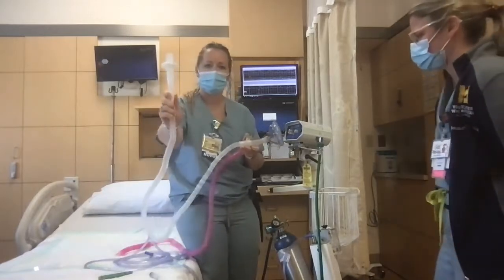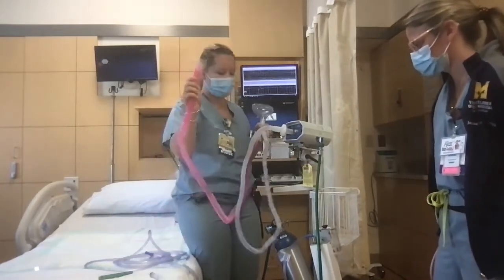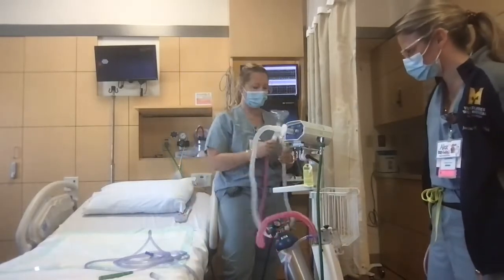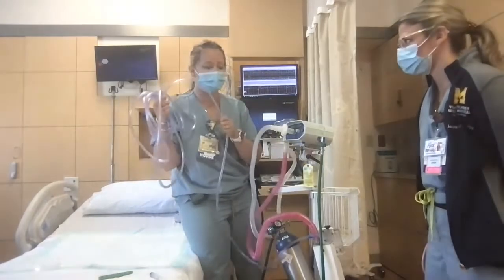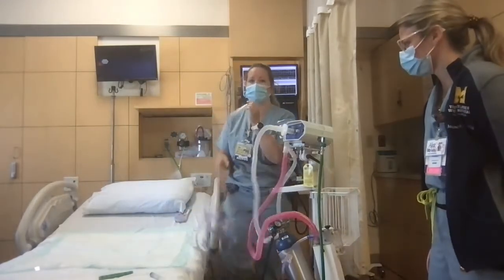This end goes to the machine. This end goes to suction. And my mask is set up. Next thing I want to do is take my suction tubing, the longer, thicker suction tubing in the supply room, and hook it up to high continuous.